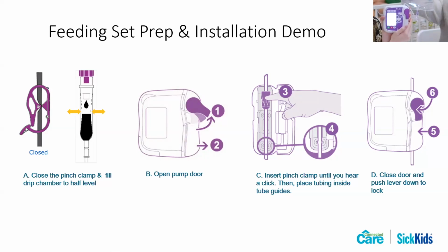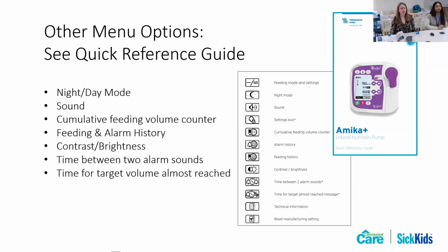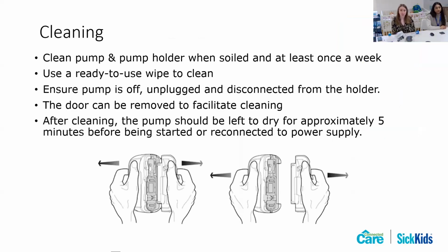Great. For our priming, I just want to emphasize that we are going to be disconnected from our patient's enteral tube. At the distal end, we don't want to be priming fast, large volumes of feed into the child's feeding tube. And the last part that we'll talk about is cleaning the pump.